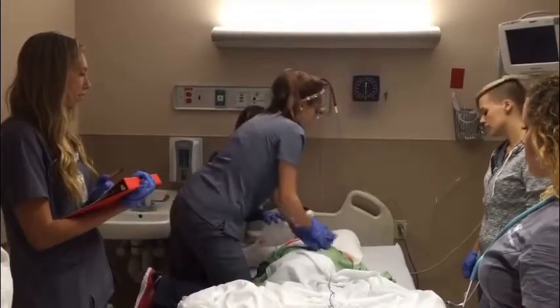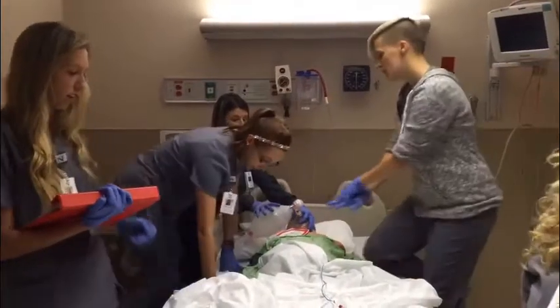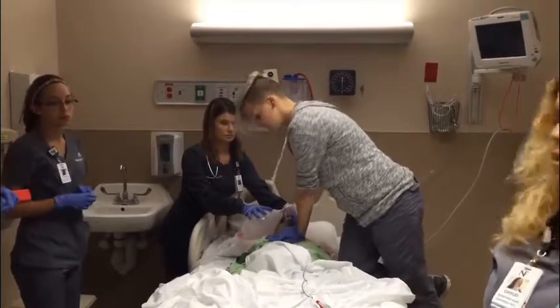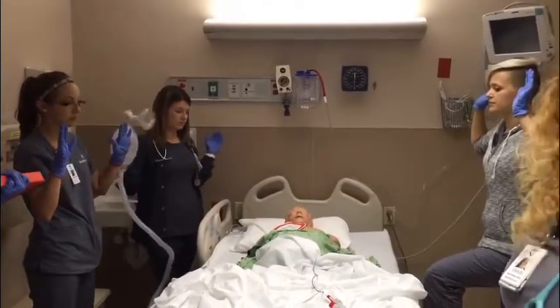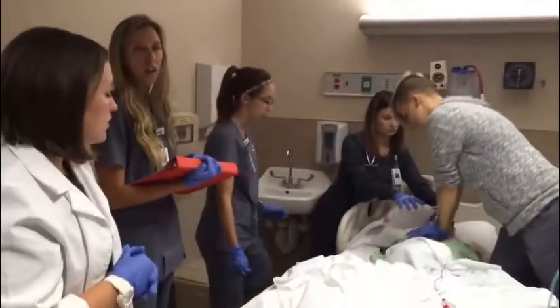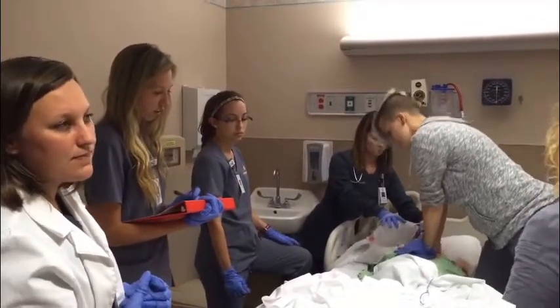It's been 2 minutes. All right, let's also check for a pulse. Still no pulse. Charging. All right, let's get ready to defibrillate at 200 joules, please. I'm clear. You're clear. We're all clear. Clear. Shocking. Shock delivered. All right, Amy, could you also pull up a milligram of epi, please? 1 milligram of epi drawn up. Thank you.